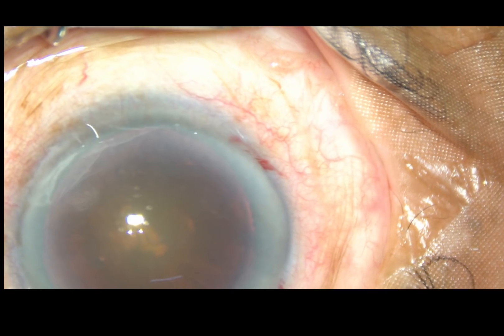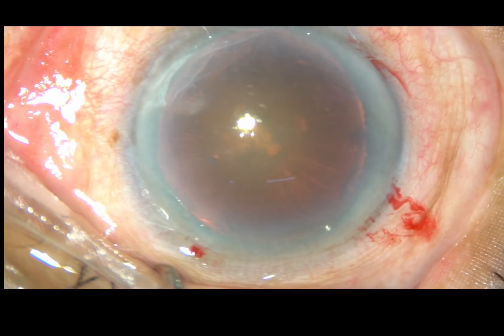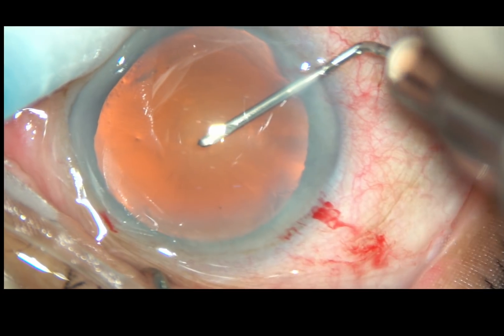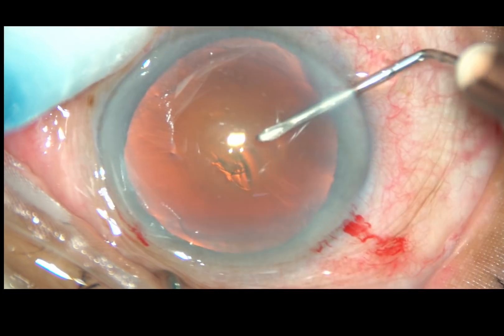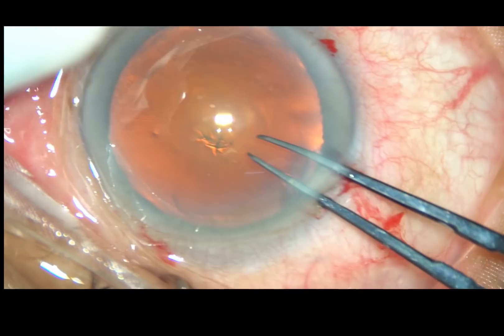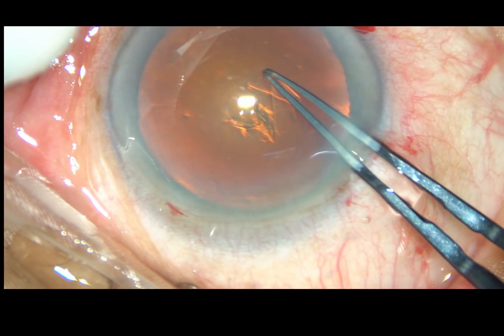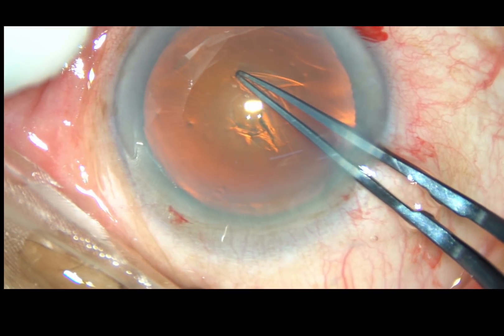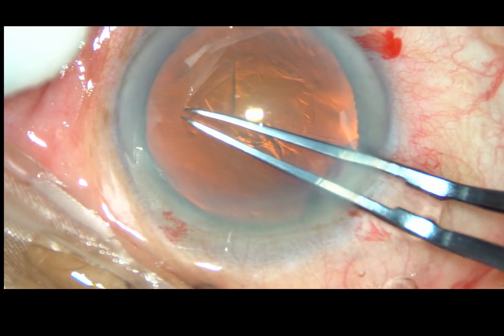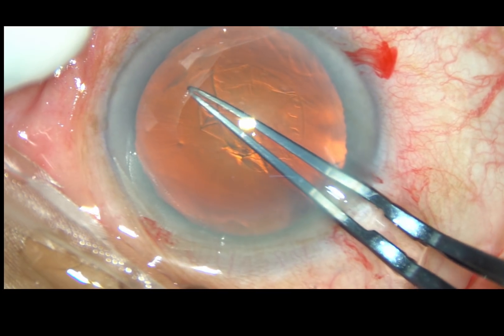By this time, the main incision and two side ports have been made. Now I am going to do capsulorhexis. The anterior capsule has been incised and the capsular flap has been raised. Now I am taking the utrata forceps and going all around about 360 degrees, tearing off some zonular fibers which are on the way.